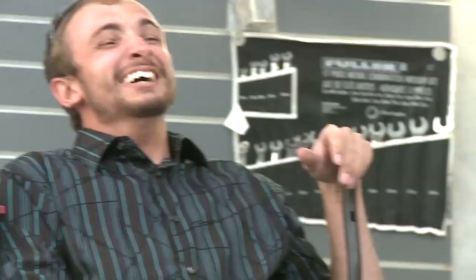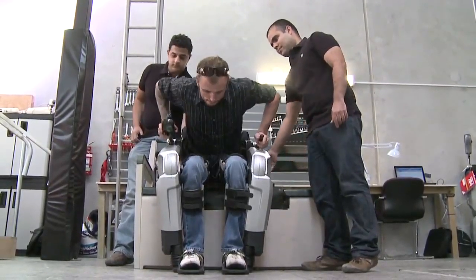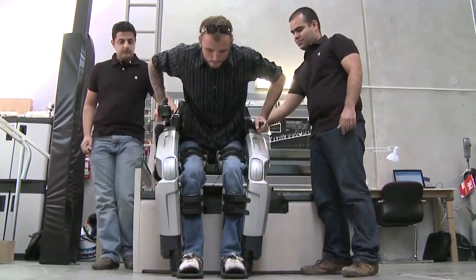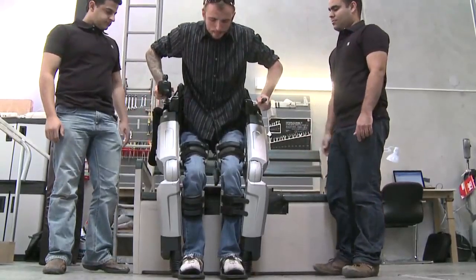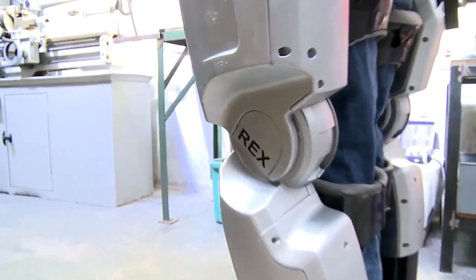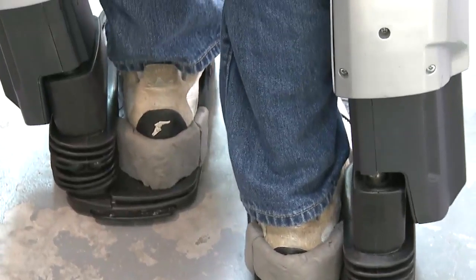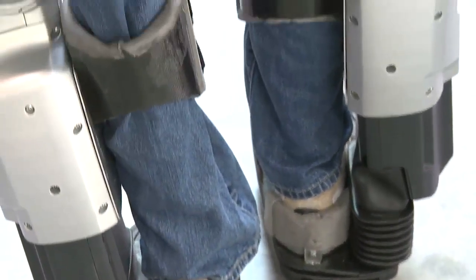The experience of getting back onto two legs, just so to speak, and walking around — it's been a real big experience in a sense. It throws you a hundred million emotions all in one day that you didn't expect to go through. You're like, OK, we're going to get back walking, but you didn't expect it to sort of take your breath away the way it does. And you go home after having a good go on it, and just all these possibilities of what you're going to be able to do again keeps coming back to you. So it's really emotional, but really fantastic at the same time.